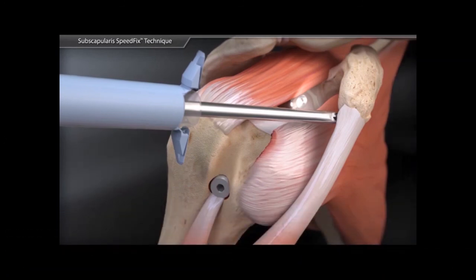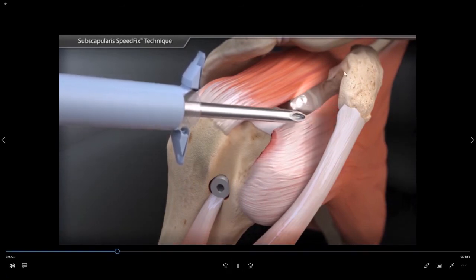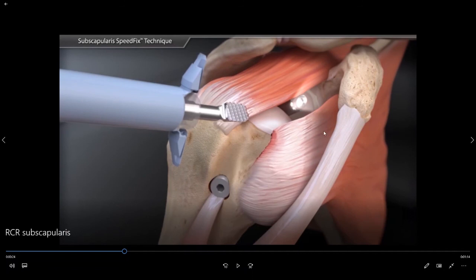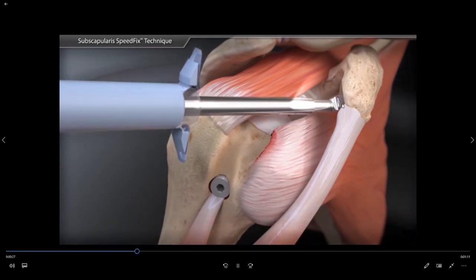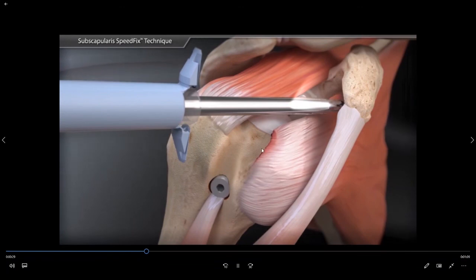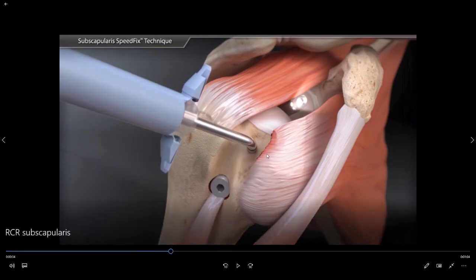Initially we want to come in and remove any spurs on the undersurface of this bony prominence right here. This is called the coracoid process, and a bony spur in this area can dig into your subscapularis tendon, causing impingement of the tendon and leading to these sorts of tears. So now we have opened up the space underneath the coracoid to allow more room for this subscapularis tendon.